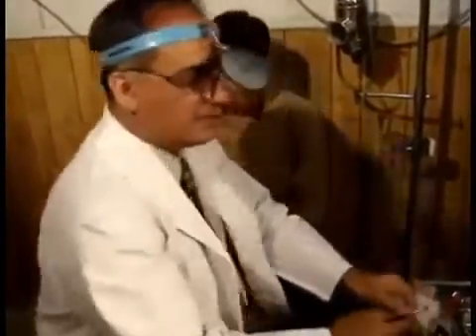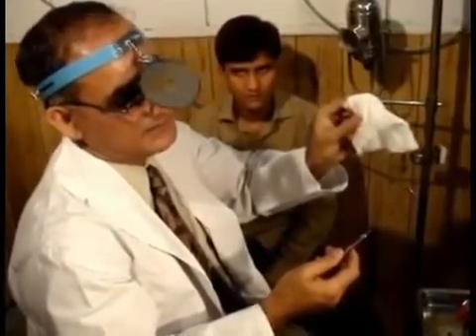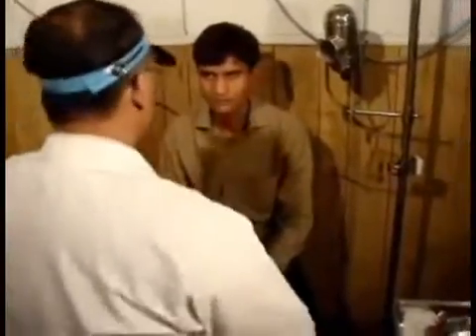Then for posterior laryngoscopy, indirect laryngoscopy, we use the indirect laryngoscope mirror, and we use this cotton square gauze. With the square gauze, we'll hold the tongue, and with the help of this mirror, we'll examine the larynx. We'll demonstrate this in a minute. So we'll start with the examination of the oral cavity and oropharynx.